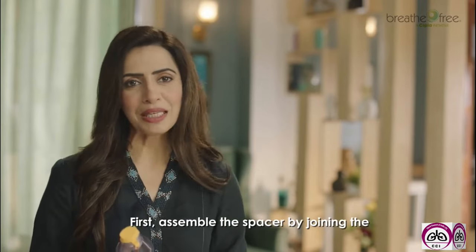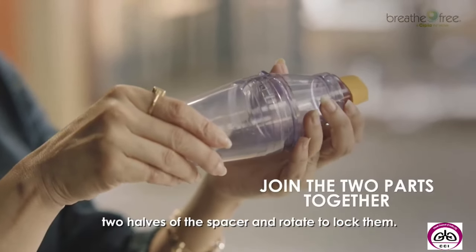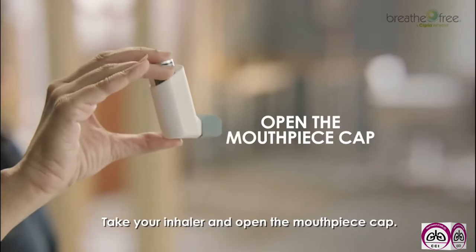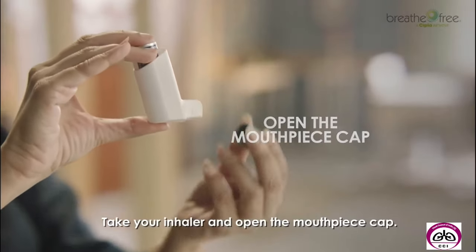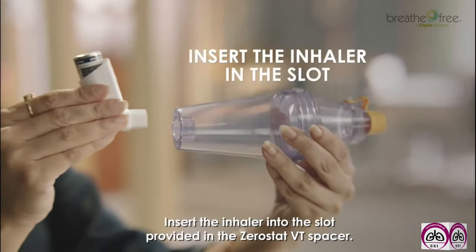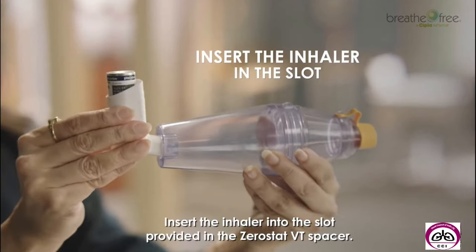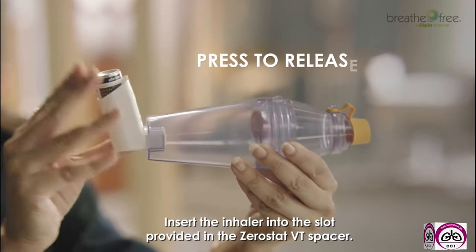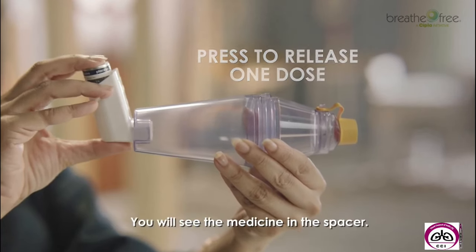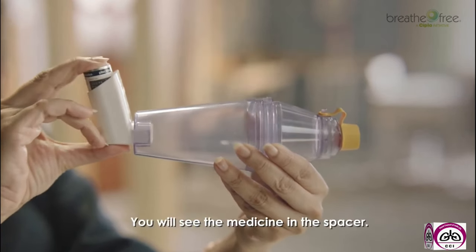First, assemble the spacer by joining the two halves of the spacer and rotate to lock them. Take your inhaler and open the mouthpiece cap and give the inhaler a good shake. Insert the inhaler into the slot provided in the Zerostat VT spacer. Press down the canister to release a dose into the spacer. You'll see the medicine in the spacer.